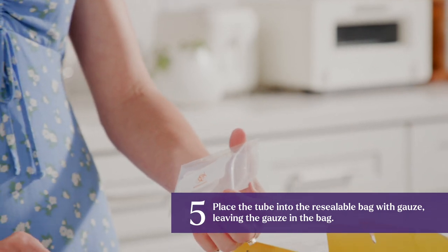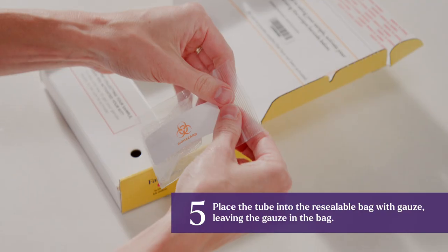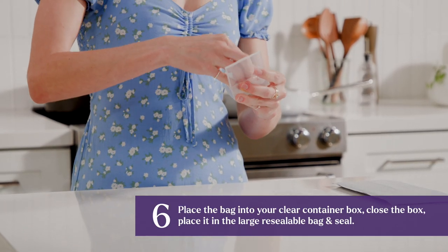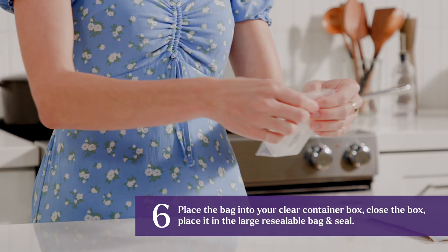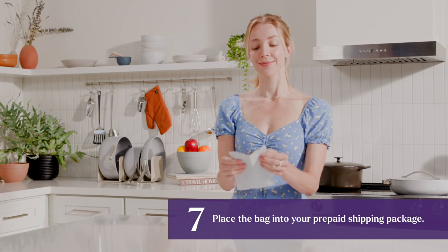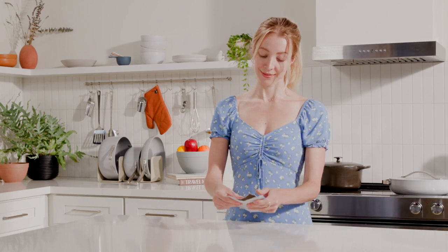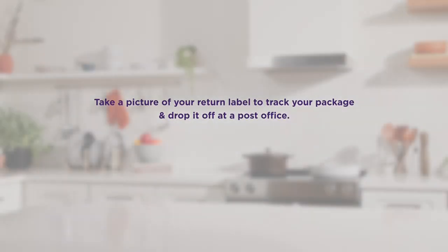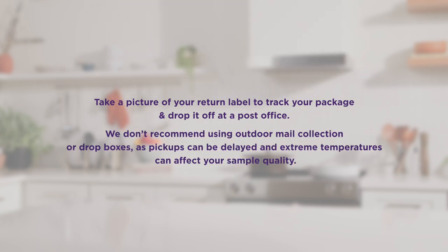Place the tube into the resealable bag with gauze, leaving the gauze in the bag. Place the bag into your clear container box, close the box, and place it in the large resealable bag and seal. Place the bag into your prepaid shipping package. Take a picture of your return label to track your package and drop it off at a post office. We don't recommend using outdoor mail collection or drop boxes, as pickups can be delayed and extreme temperatures can affect your sample quality.